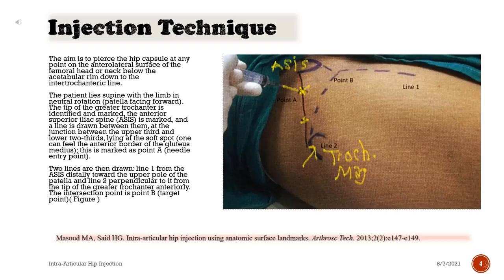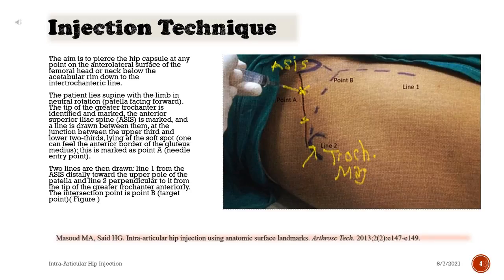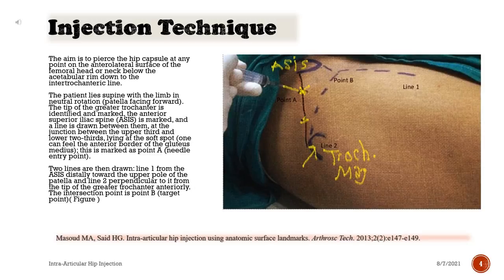The aim is to pierce the hip capsule at any point on the anterolateral surface of the femoral head or neck, below the acetabular rim down to the intertrochanteric line. The patient lies supine with the limb in neutral rotation, patella facing forward. The tip of the greater trochanter is identified and marked. The anterior superior iliac spine (ASIS) is marked, and a line is drawn between them. At the junction between the upper third and lower two-thirds, lying at the soft spot, one can feel the anterior border of the gluteus medius — this is marked as Point A (needle entry point). Two lines are then drawn: Line 1 from the ASIS distally toward the upper pole of the patella, and Line 2 perpendicular to it from the tip of the greater trochanter anteriorly. The intersection point is Point B (target point).